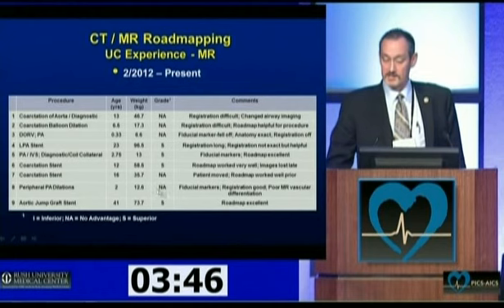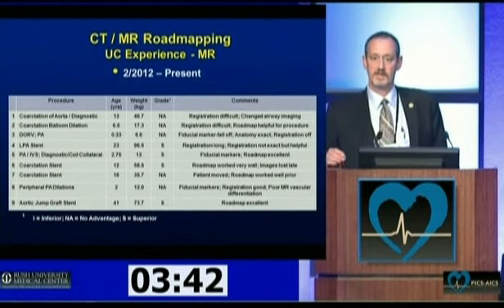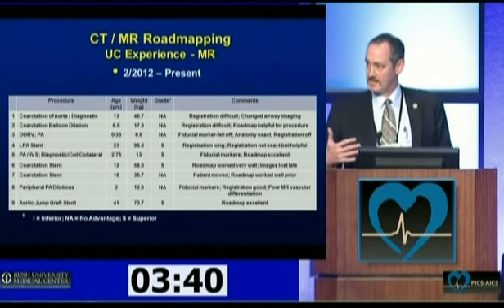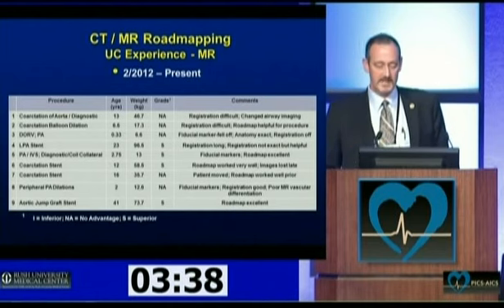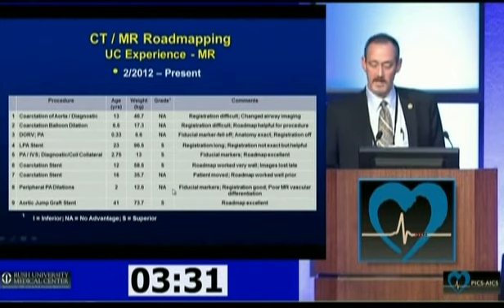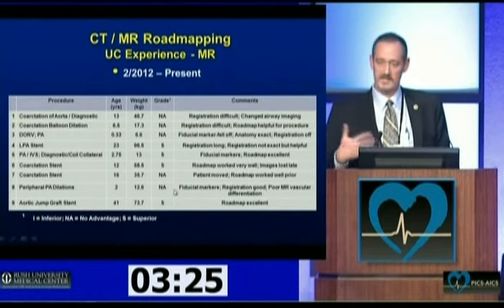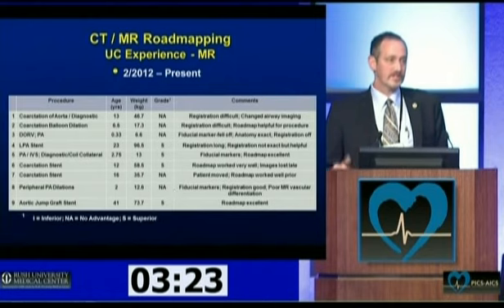Our next one ended up being pretty complex pulmonary arterial disease, and it was more an issue of the quality of the images that we got from an outside institution, which we thought fairly well represented pretty proximal stenosis of the branch pulmonary arteries. As it turned out, we had fairly discrete and multifocal distal stenosis, which wasn't picked up on the MR based on the type of acquisition done.